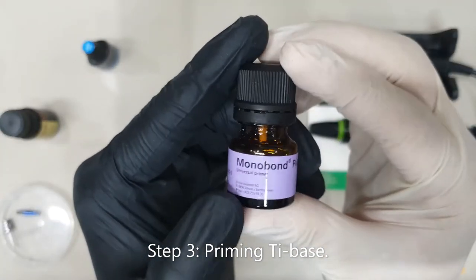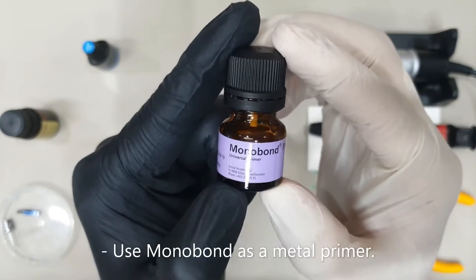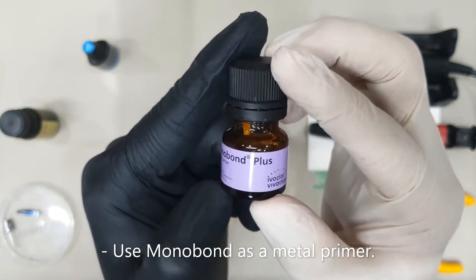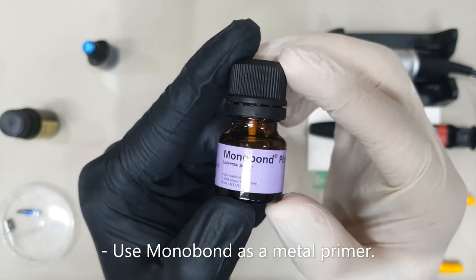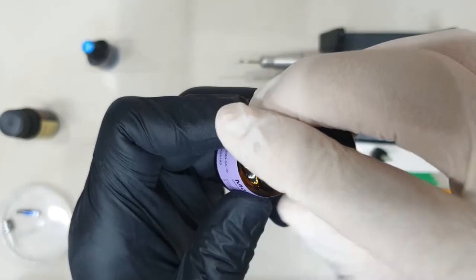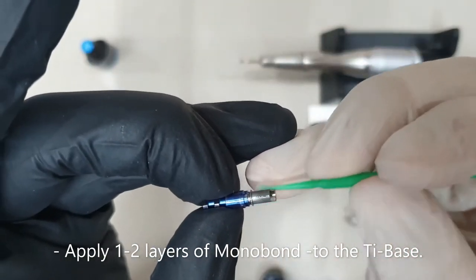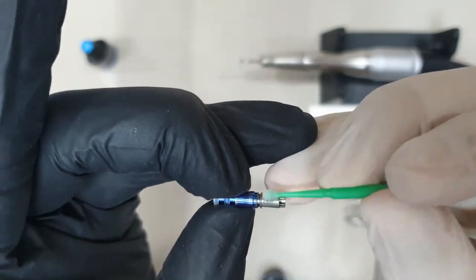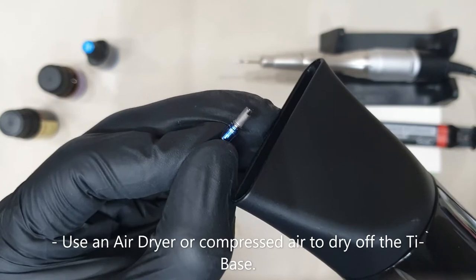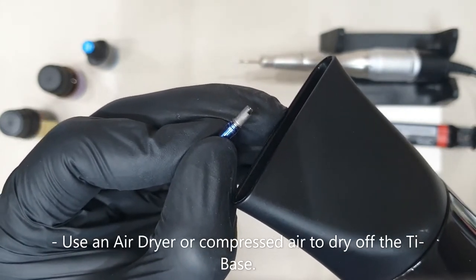Next will be the bonding process of the ti-base to my crown. In order to prime the metal, I'll place a little bit of mono bond on the surface of my titanium base just to prime it and prepare it for bonding. To dry the ti-base, we could either use compressed air or an air dryer.